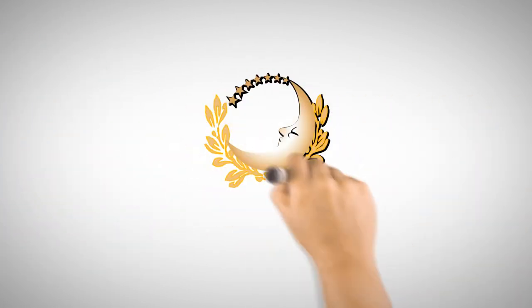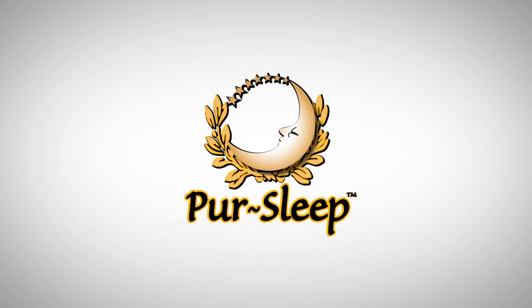Enjoy the benefits of effective CPAP therapy with the CPAP Fit Pillow from PureSleep.